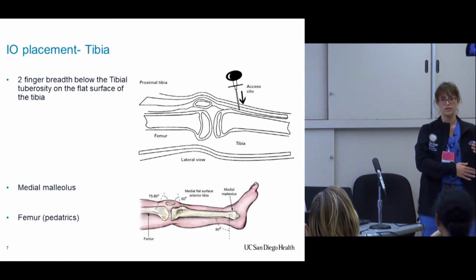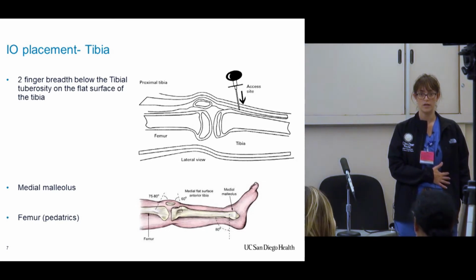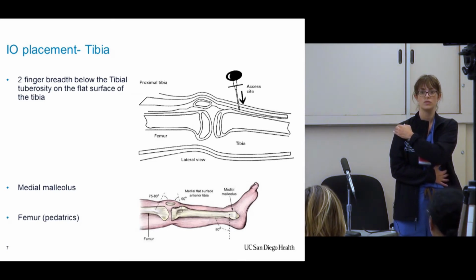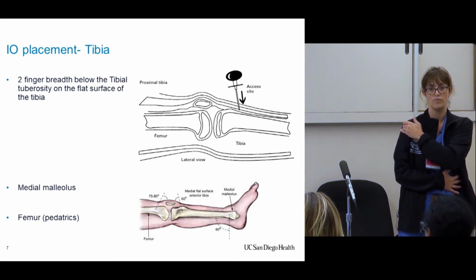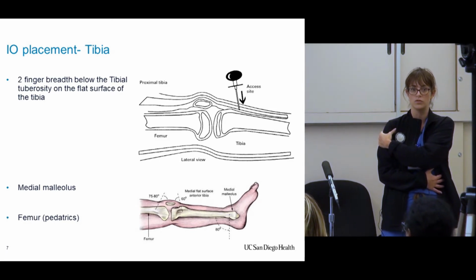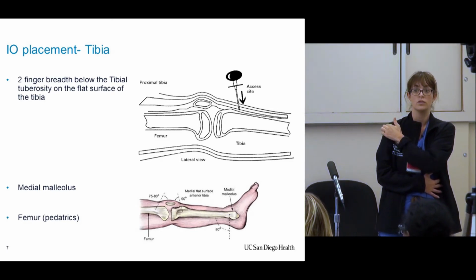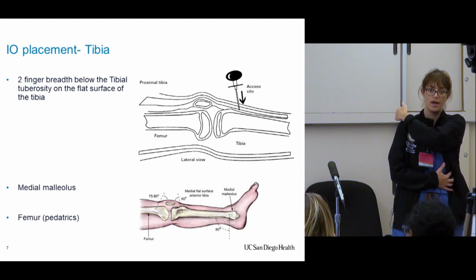So the easiest way to feel it is actually, and you do this with a patient as well, arm across the belly in resting position, and that actually moves the ligaments out of the way so that there's a sort of bald spot in between where you have more direct access to the humerus. If you feel, it's a little hard, especially if you have a well-developed deltoid, to feel it. It's also why it's a longer needle, because there's muscle there in the way. But I actually find it's easier if I go from above down rather than from below up. But there's going to be a bulb, and then it drops off, and you're going to go just above that, but angle down and toward the scapula.